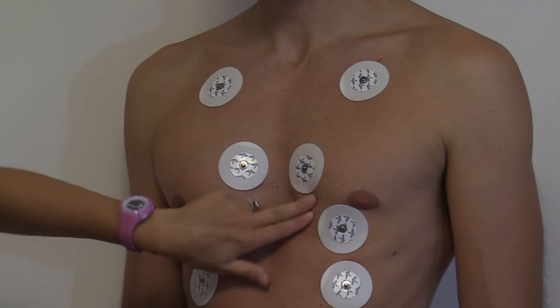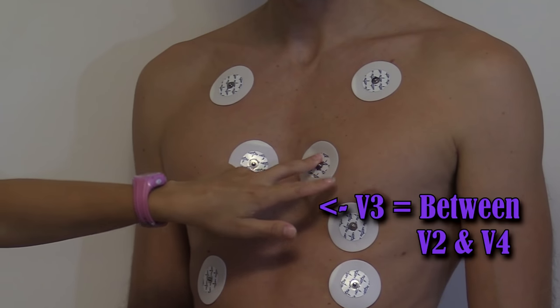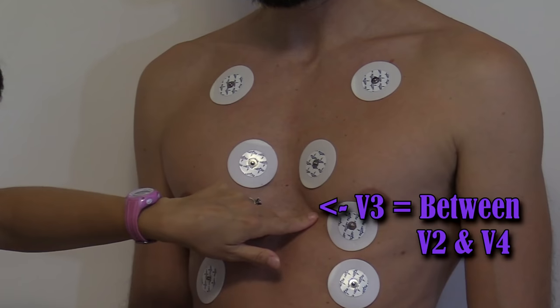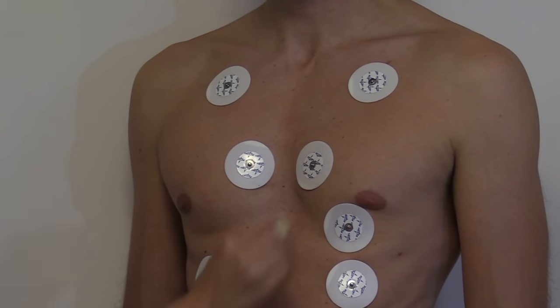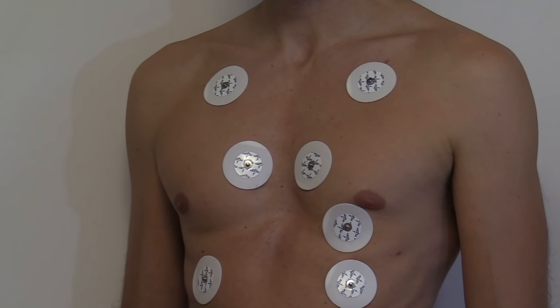Now we're going to go back to V3. V3 is in between V2 and V4, so we're going to go right there. Cleanse the skin, rough it up, and place our electrode.